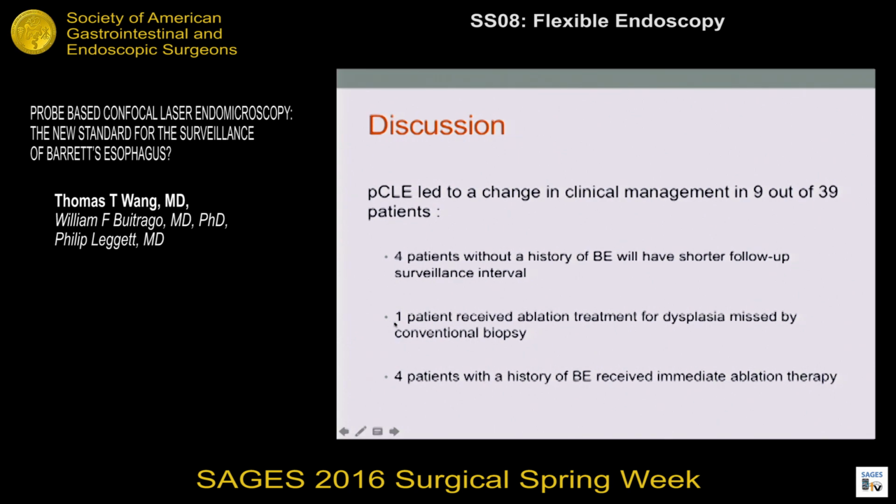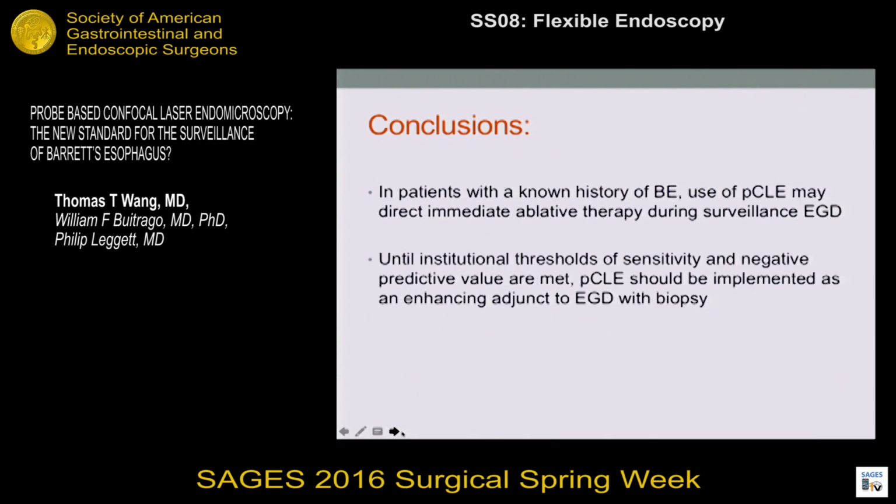In one of our patients, dysplasia was diagnosed by optical biopsy, and this was confirmed and validated by an experienced anatomic pathologist, and this degree of dysplasia was missed on pathology. Therefore, this patient benefited from treatment for this dysplasia. And lastly, 4 of our patients who had a known history of BE underwent immediate ablation therapy during this procedure, saving them from another procedure.